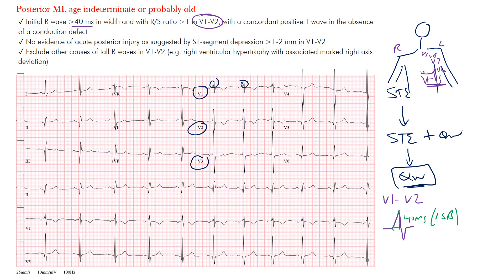This patient had an inferoposterior MI — both inferior and posterior involvement. Remember, the inferior wall and the posterior wall may be involved together because a patient may be right dominant. In a previous lecture we looked at dominance: most patients are right dominant, meaning the posterior descending artery (PDA) is fed by the right coronary artery.